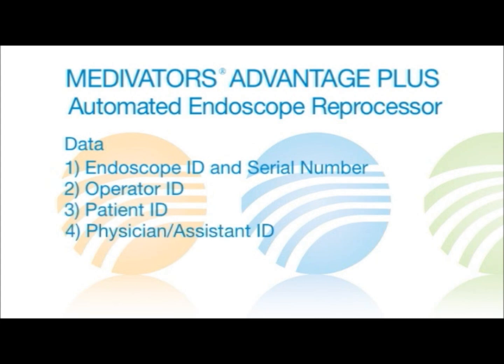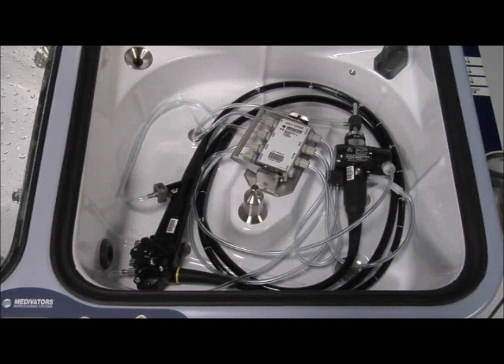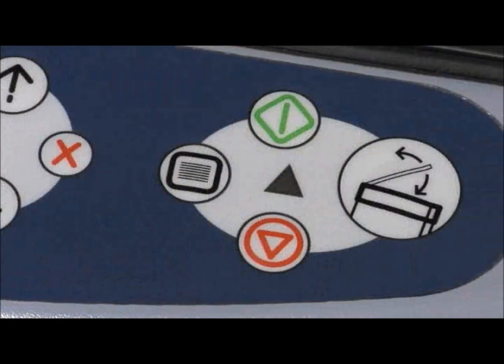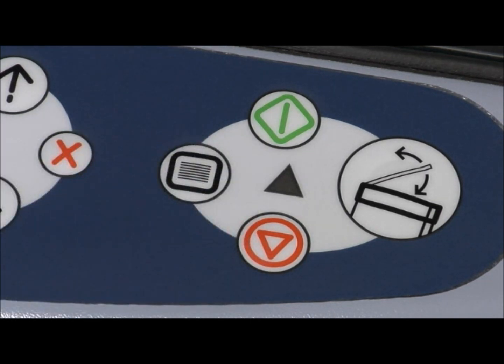The information requested will vary depending on how the Advantage Plus was set up. After the endoscope has been loaded into the basin, press the menu button on the basin side you would like to start. If you place the endoscope in the right basin, press the menu button on the right side.